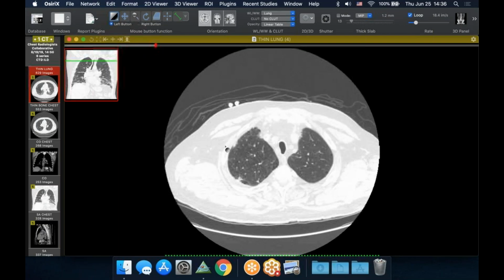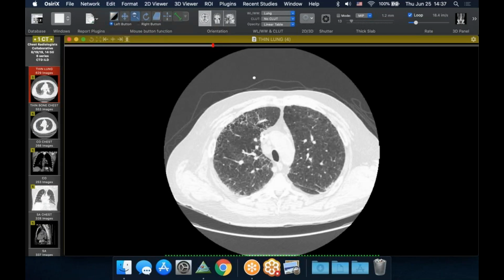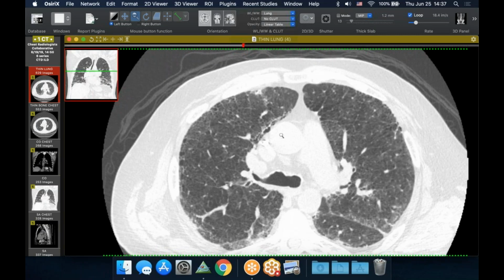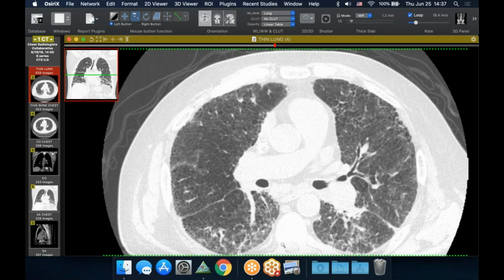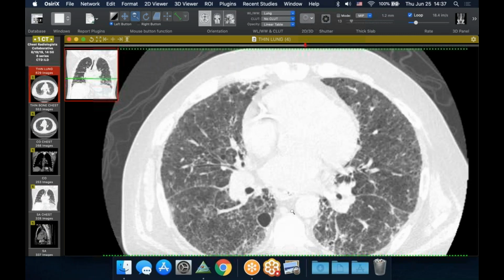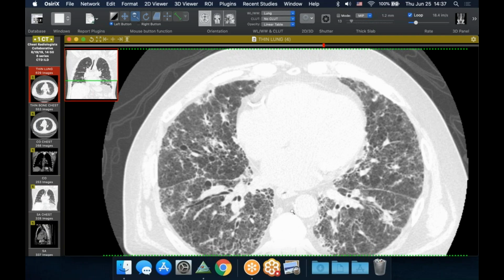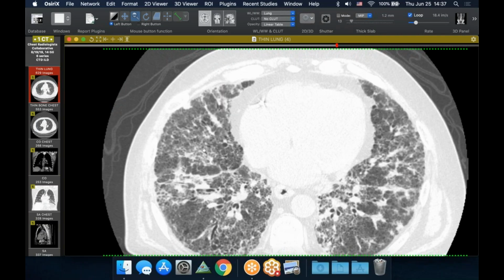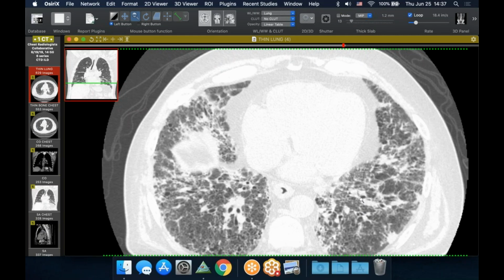So you can see there's some emphysema. I'm waiting for it to load the stack here so it gets a little bigger. Make it a little bigger. There we go. And you can see, so you got some fibrosis mixing with emphysema. It's very subpleural predominant. There are some more central bands. As we go further down, you can see it's clearly a basal predominant process, but it's not so exquisitely subpleural in the lower lobe. So this is hard to specifically give this pattern a name. It's definitely not a UIP pattern. It's way too much central disease, but it's a CTD, so they're often mixed or have some NSIP features.